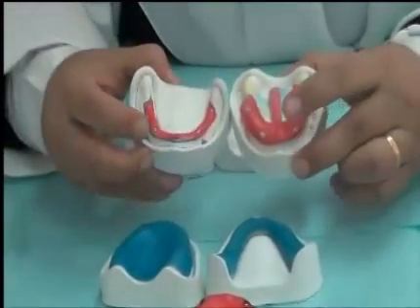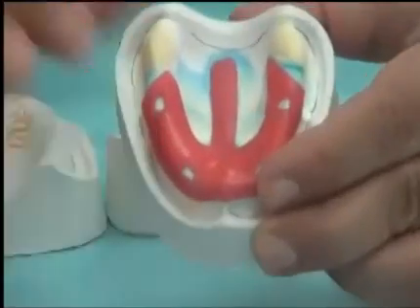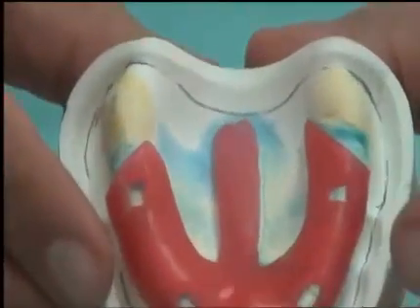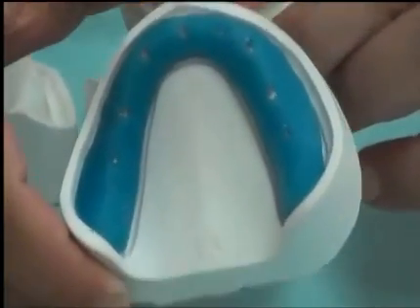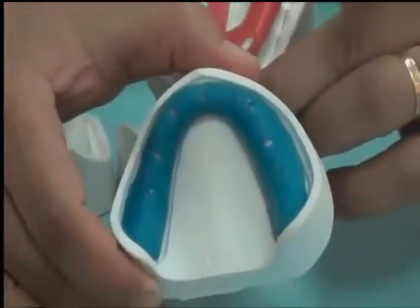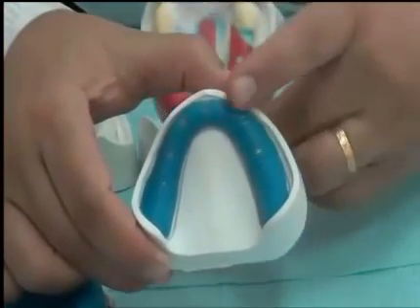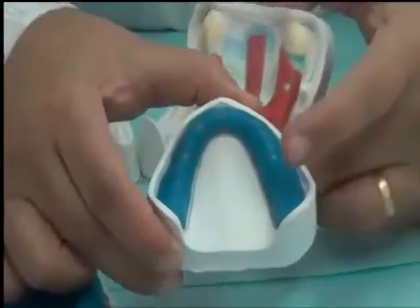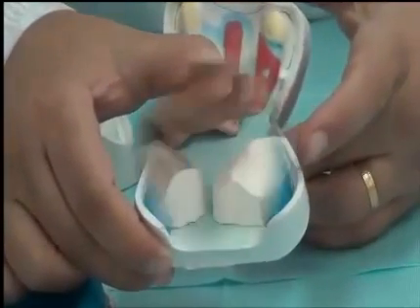For your lab work, you will be doing the upper partial relief wax, and then we'll place the tray material over it. And for the lower, you're going to do the perforated way of relief, for you to have experience in both methods of relief. So for the upper, we're going to do partial relief, and for the lower, we're going to do whole relief against the tissue that we need to be static.